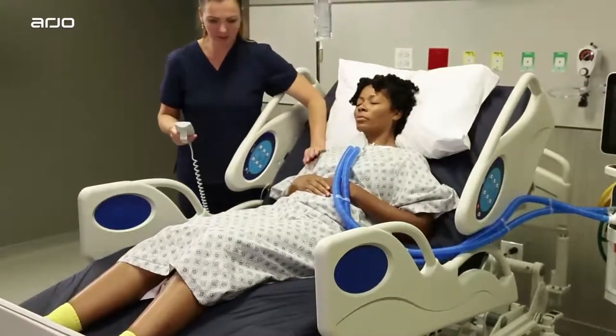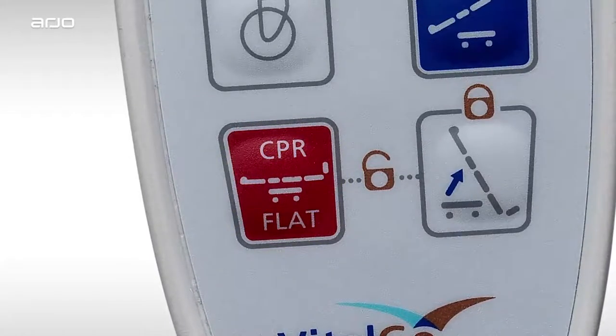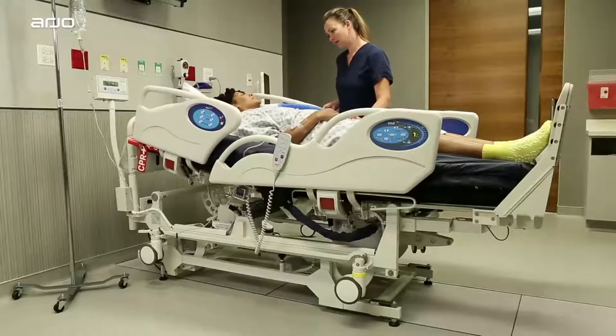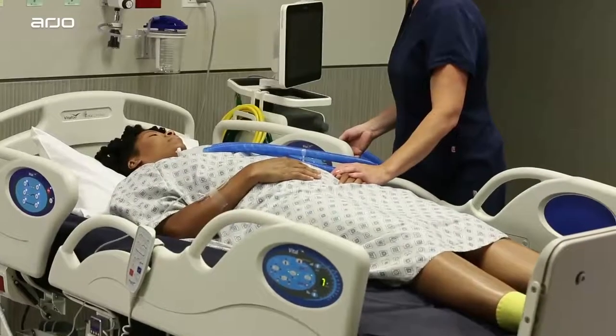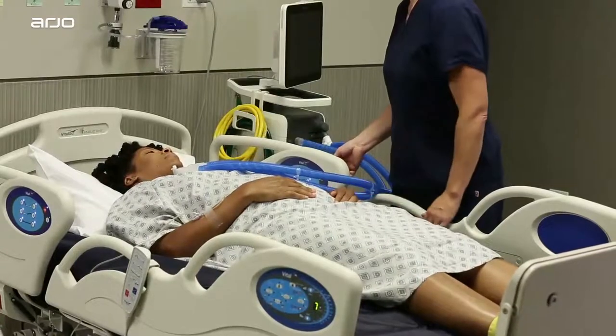Unlocking is not required to lower the bed. In addition, enabling the CPR mode automatically unlocks the bed and takes it to an ideal horizontal position, no matter the current tilt or elevation. Just press the CPR button to lower the bed from any position to a flat CPR position.